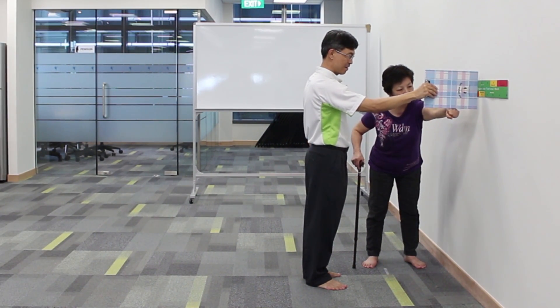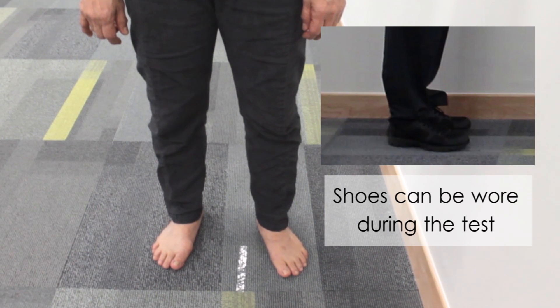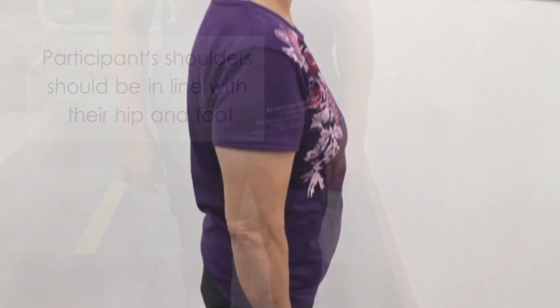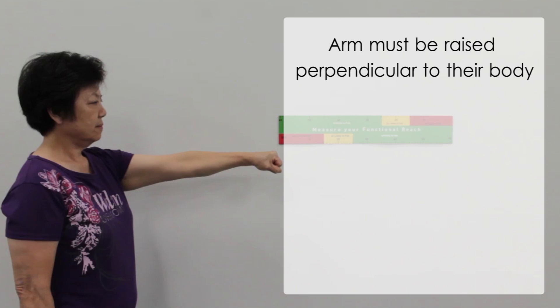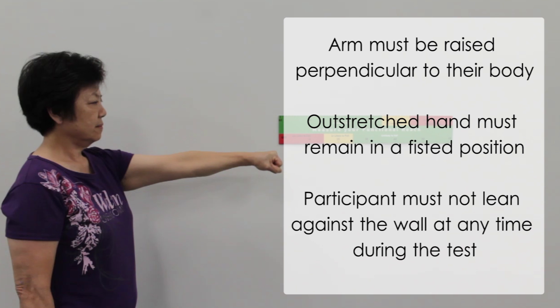There are a few things you should take note of. The participant's feet should be positioned shoulder width apart. Shoes can be worn during the test. However, if the footwear may cause the participant to lose balance, remove their socks and shoes. The participant's shoulders should be in line with their hip and foot. Arm must be raised perpendicular to their body. Outstretched hand must remain in a fisted position. The participant must not lean against the wall at any time during the test.